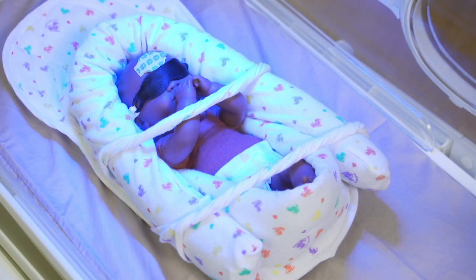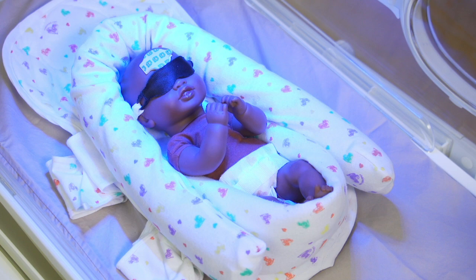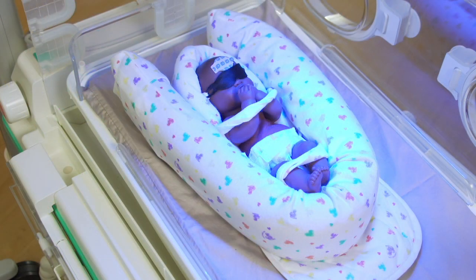During phototherapy, if overhead lights are in use, twist the straps to make them smaller and minimize the amount of space they occupy, or remove them and tuck them under the Snuggle Up. If panel phototherapy is in use, you may turn the Snuggle Up around and use a bendy bumper at the feet to accommodate the cable between the panel and the light source.